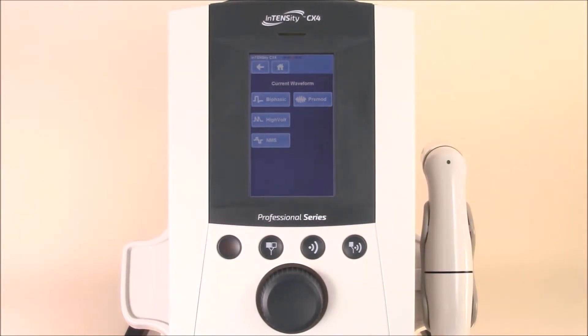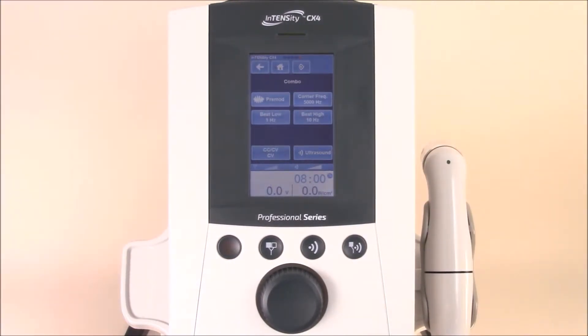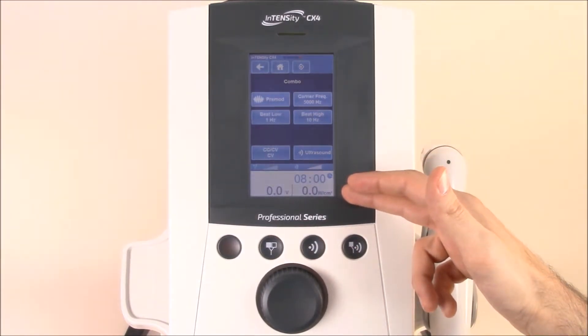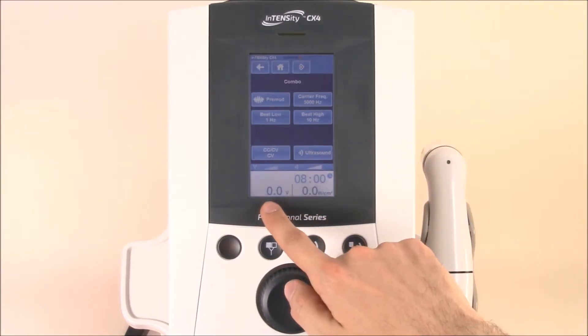Let's use pre-mod for demonstration purposes. On the first screen, you'll see all of your electrotherapy options and parameter settings. You can still adjust the timer, and you can still control both power options for ultrasound and electrotherapy.